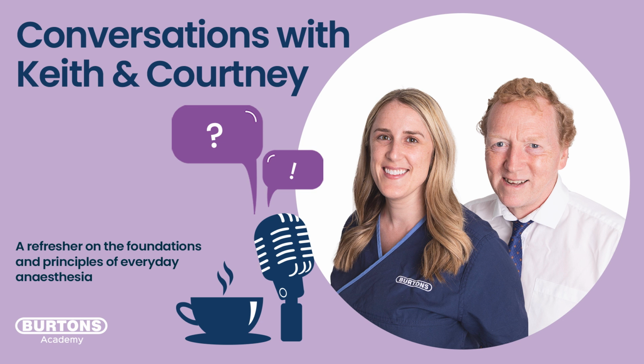We'll come on to what that actually means in a while. So it's a good pulse counter. It does give you an indication of some degree of pulse volume, but we'll cover that as well in our podcast. It's one of the tools that we think is our go-to for assessing oxygen delivery to the patient, but it's got its limitations.